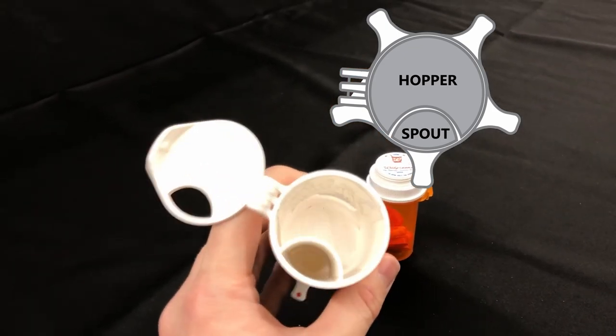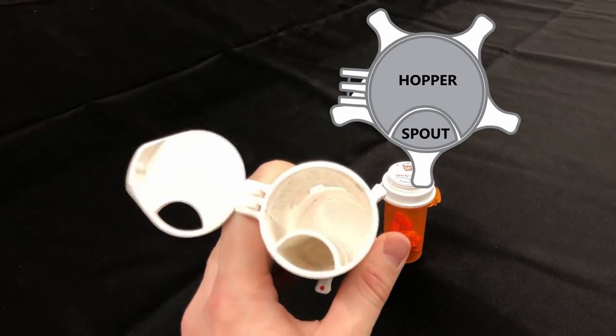The smaller opening seen at the bottom is the spout. When dispensed, pills will exit through this tube.